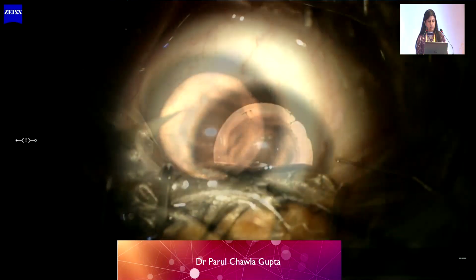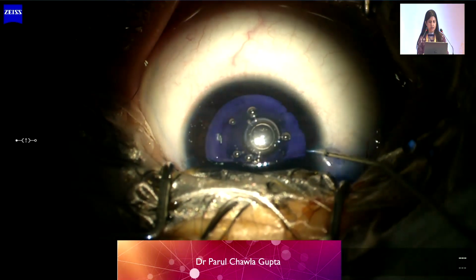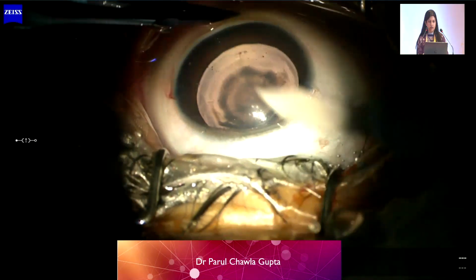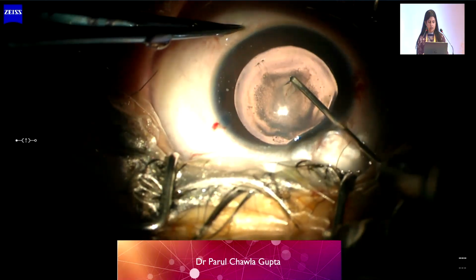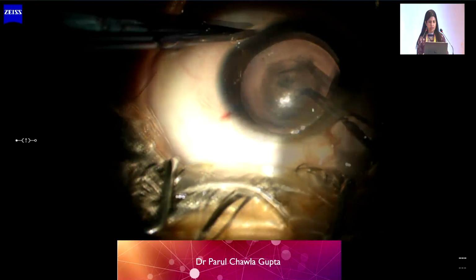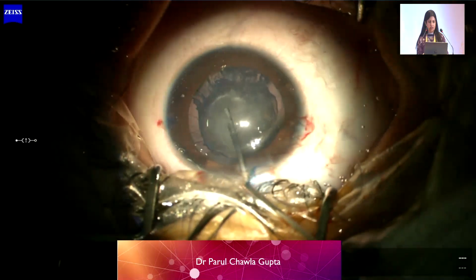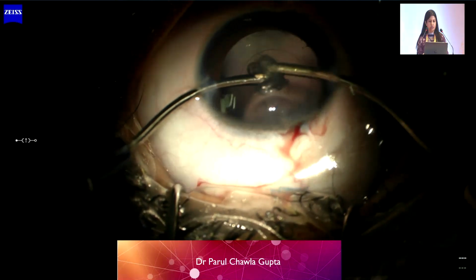This is a case of a pediatric cataract. We inject the trypan blue dye after making the uniplanar side port incisions, then wash it off. 0.06% trypan blue dye is used. Then we fill with viscoelastic, cohesive viscoelastic. Then we use the cystitome to start the capsulorhexis and complete it with a Utrata forceps. A multi-quadrant hydrodissection is done, and finally a bimanual irrigation aspiration is done.